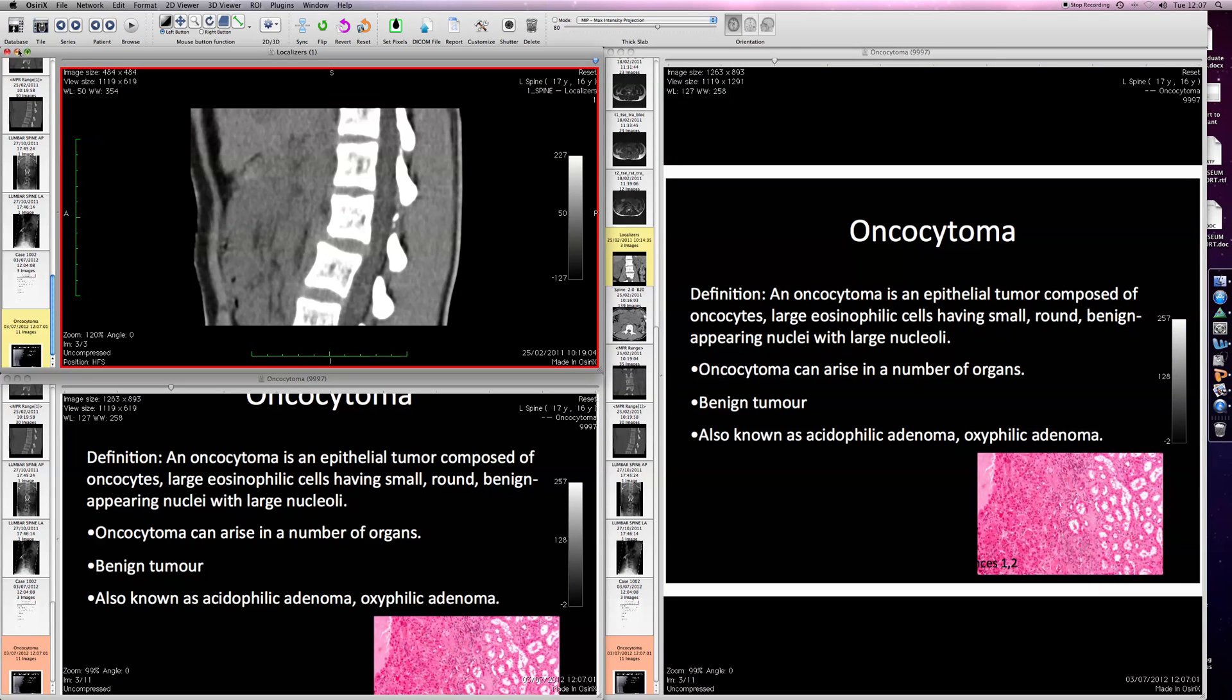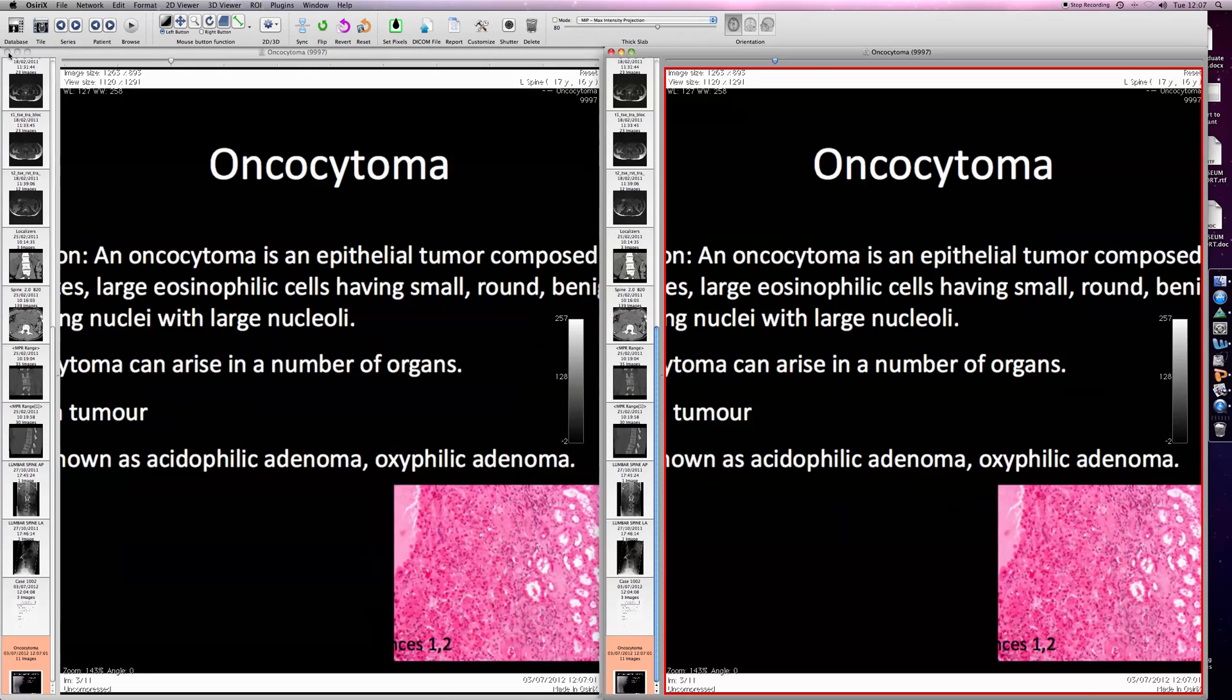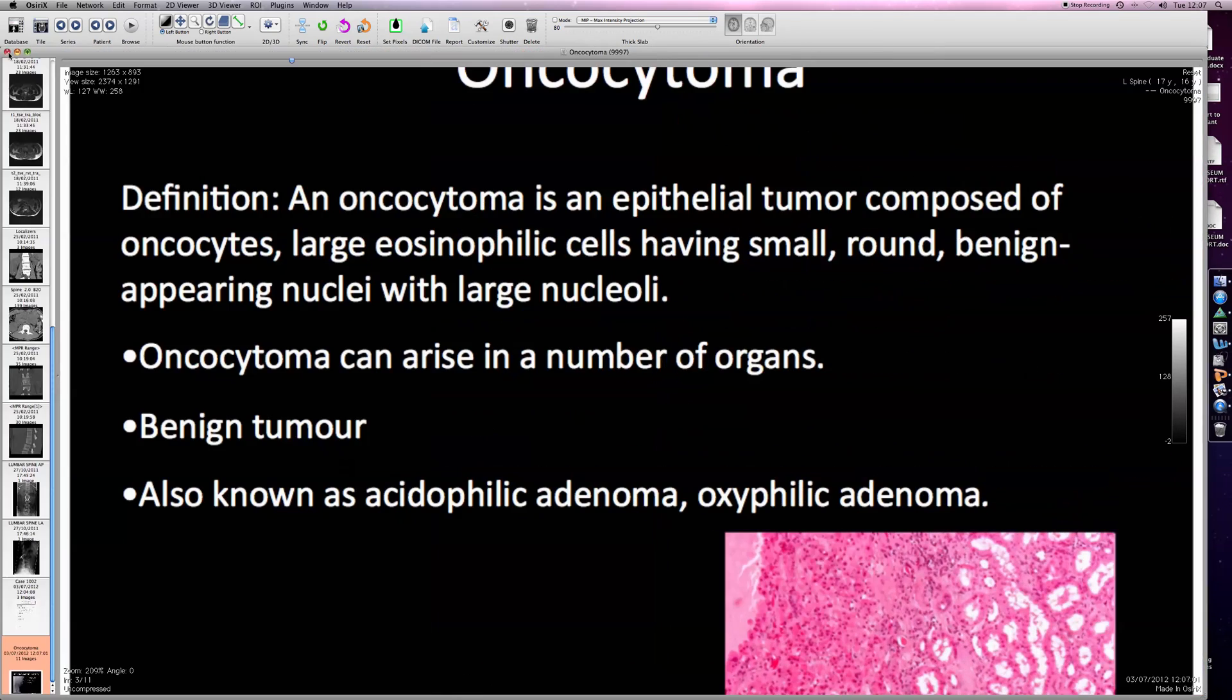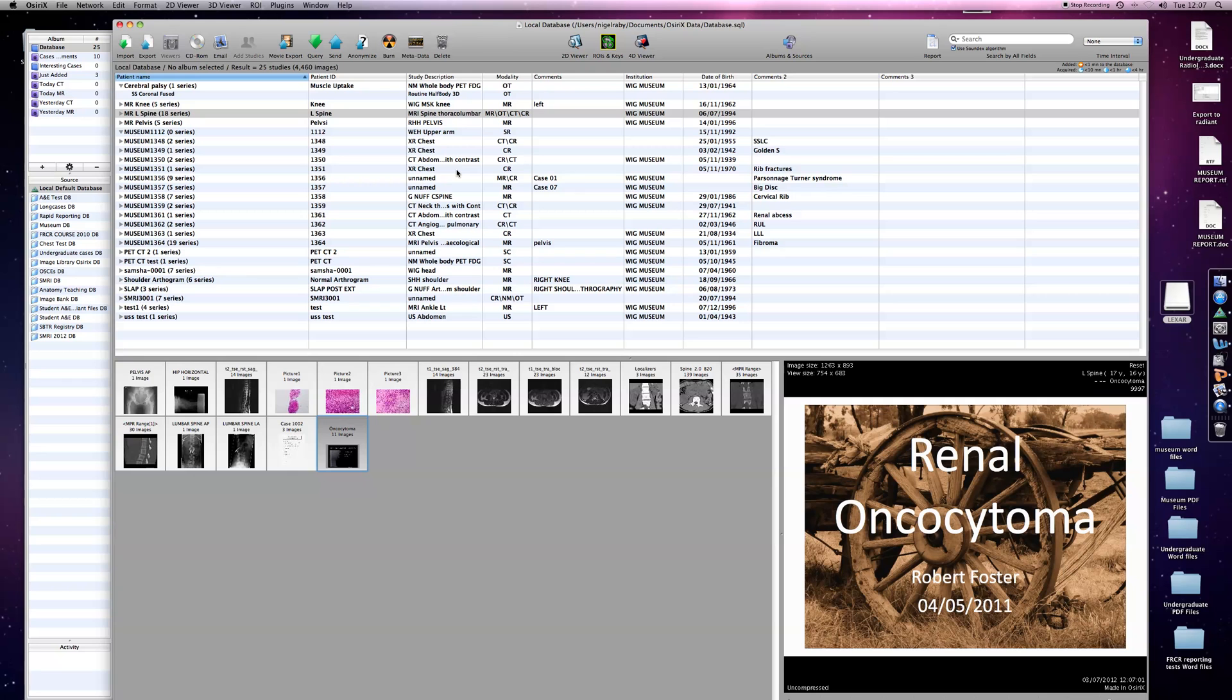So those are examples of additional material that you can add. I would stress, using the Plugins facility, you can use PDF or JPEG files, so anything you can convert to either of those can be utilized. It does require Microsoft Office for Mac installed on your Mac to be able to do this. Have fun!